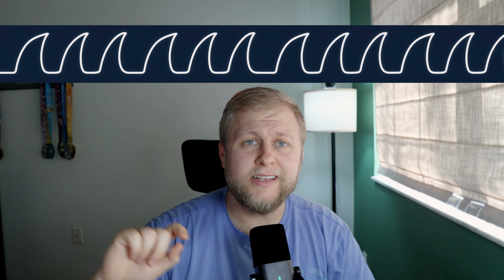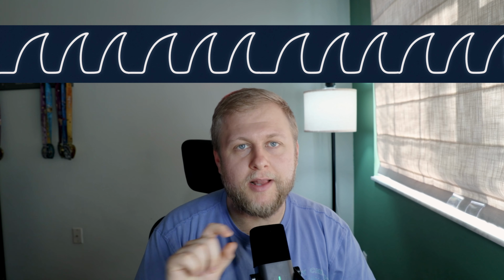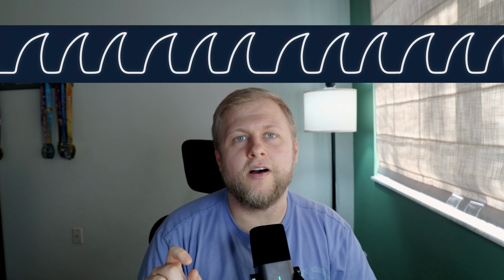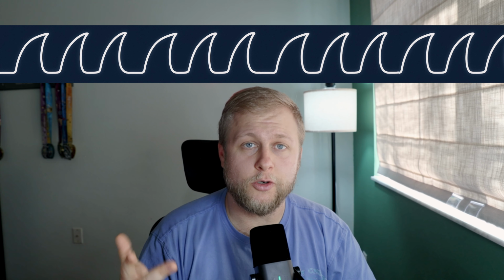A normal end-tidal waveform has a quick upstroke, a flat plateau, and a quick downstroke. If you don't have that, there's probably something going on. Let's talk about bronchospasm, secretions, and obstruction, and what that looks like. If your upstroke is sloped, like a shark fin, and your plateau doesn't stay flat, that should key you off to maybe there's something going on with either bronchospasm, secretions, or obstruction.